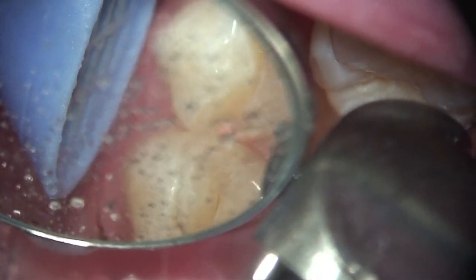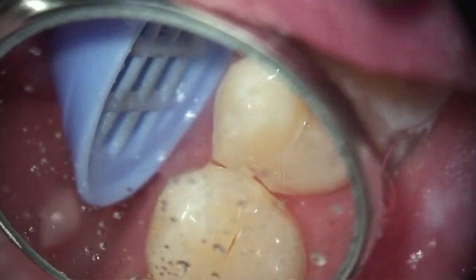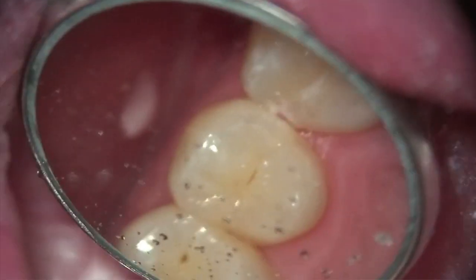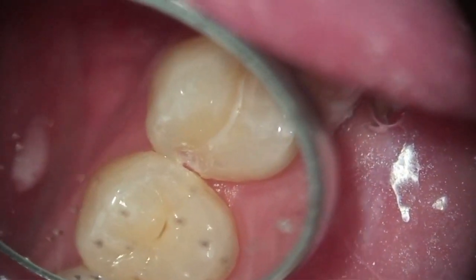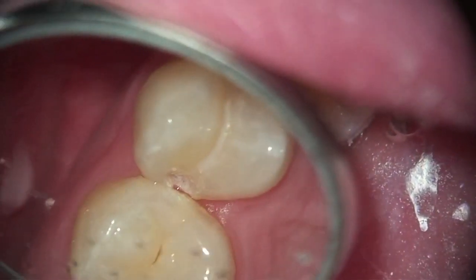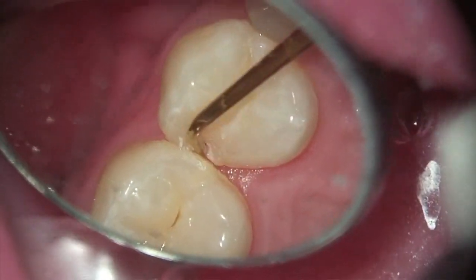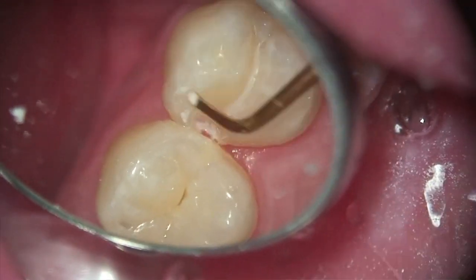It's very easy after training to learn how to control the laser beam and its direction. Once you get to a certain point in the bottom of the box, I'll change the laser settings, go back in and clean the rest of the box up, and use a spoon excavator to remove any remaining decalcified tooth structure and decay that might be present.